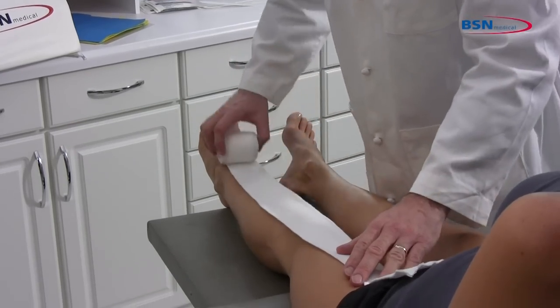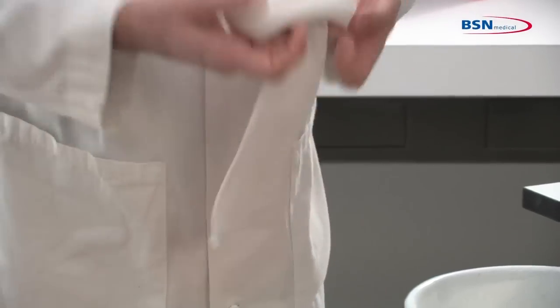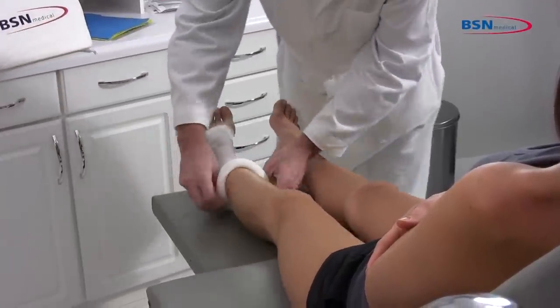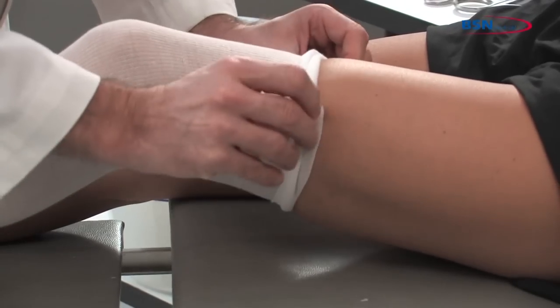Select a stockinette that will not be restrictive at the widest part of the limb. Roll up the stockinette before applying to the limb to lessen the pressure while applying. Roll on and remove all wrinkles and creases.